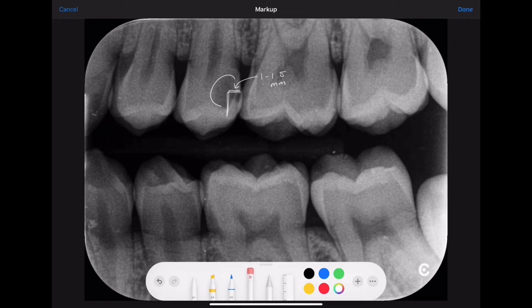So always remember that when practicing on patients, the depth of your axial wall will be determined by the extent of the carious lesion. In this example, we will have a very deep axial wall. If the carious lesion is not as far extended, your axial wall may not be as extended. However, you always need to extend your axial wall deep enough to provide convenience form.